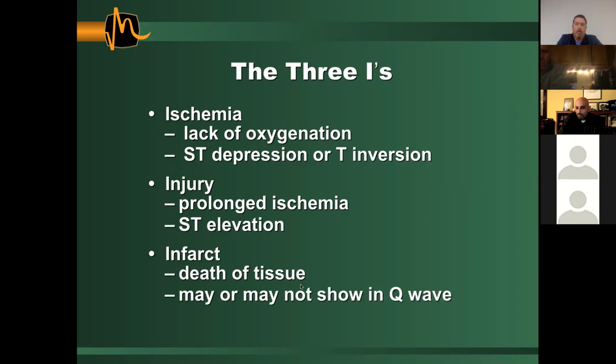That causes a Q wave. And it may or may not show up, but when it does show up, that causes a Q wave. So when we say STEMI, we're talking about this injury, even though we end up calling it infarction. If we don't treat the injury, it will become an infarction, but it's really myocardial injury.